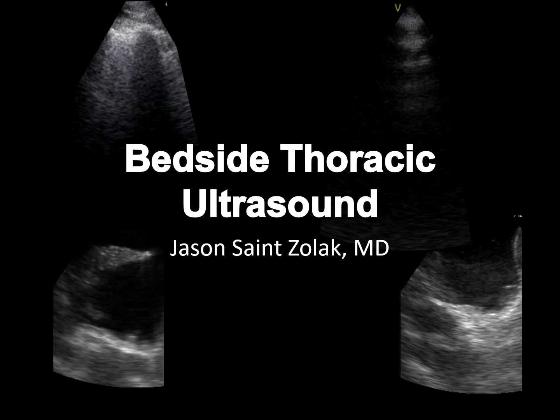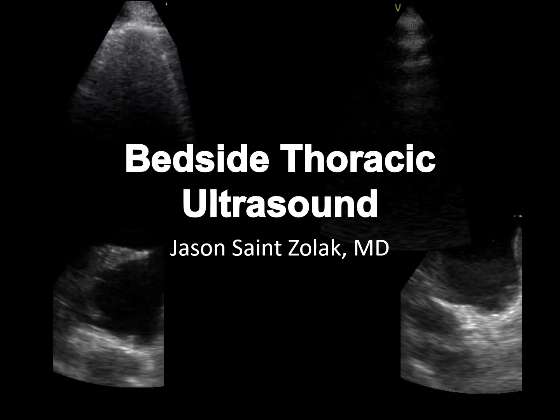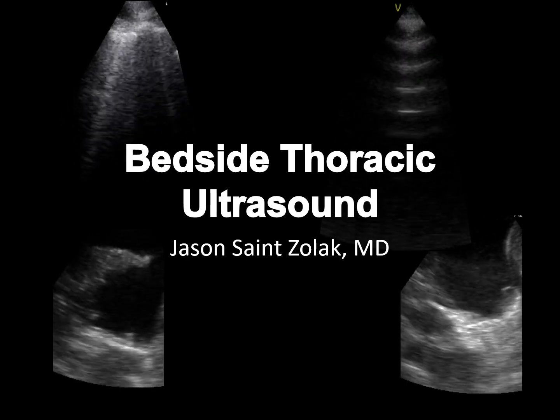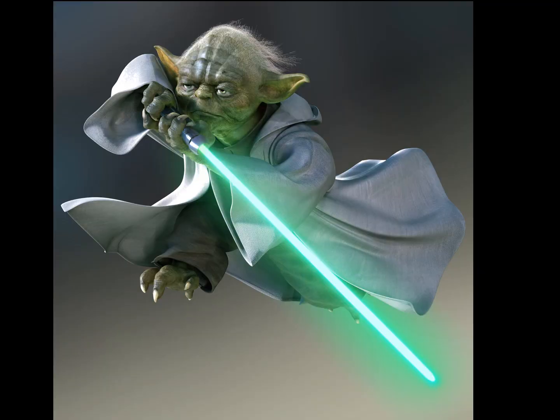After this course, you will be armed with a simple, validated approach to thoracic ultrasound. You will be able to apply this at the bedside tomorrow to accurately diagnose the cause of your patient's respiratory failure in less than 3 minutes. You will be a Jedi Master of lung ultrasound.